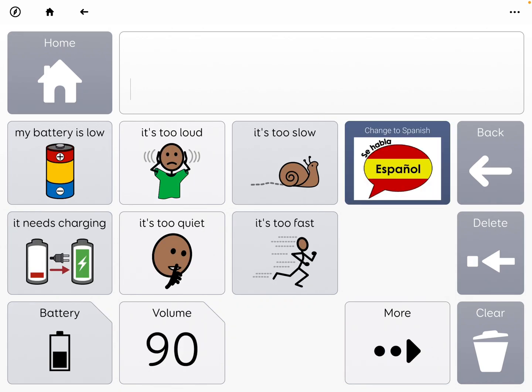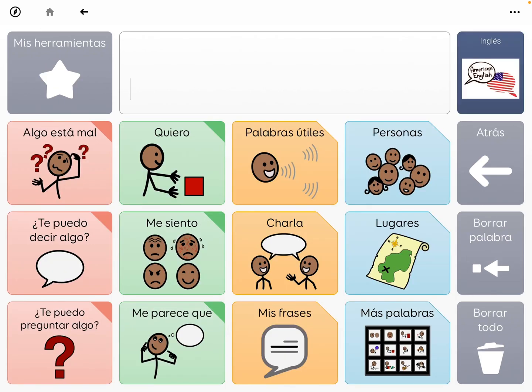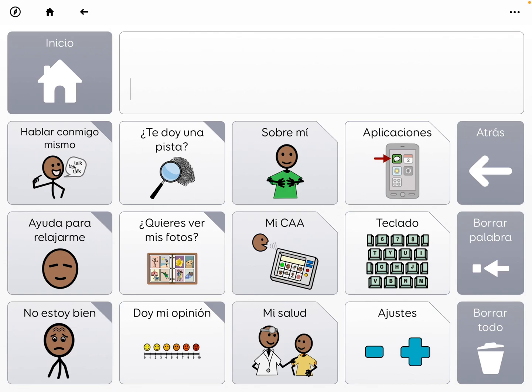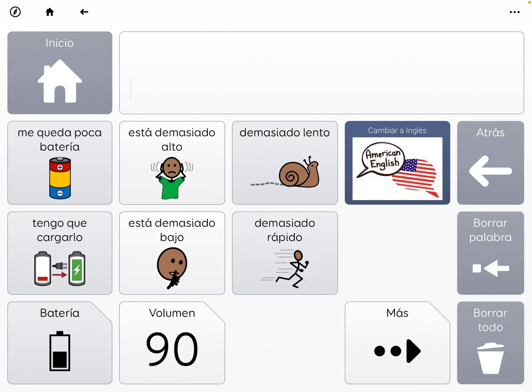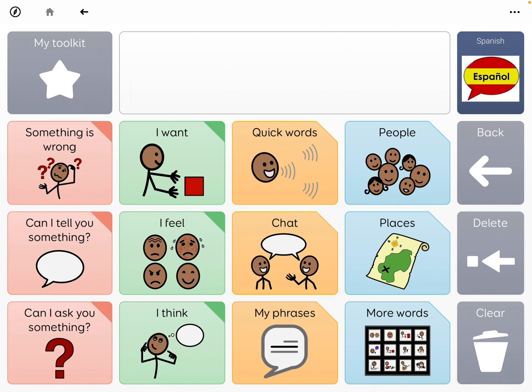They suggested creating a button there to change languages, and then you would do the same thing in multiple places. The issue I would have with that for a lot of the kids that I've worked with is that's too many taps deep, especially when they're first learning to use AAC.